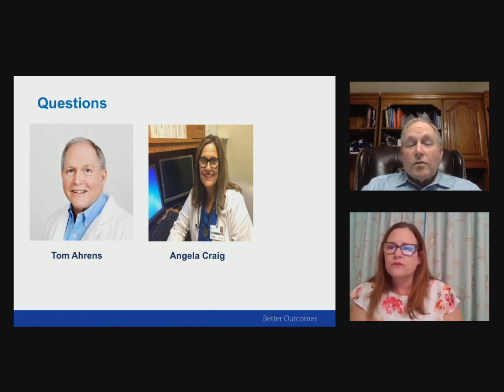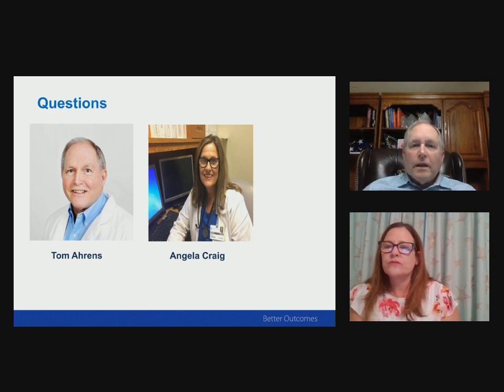Yeah, it's a wonderful question. Ideally in our COVID patients, we want to avoid intubating if we can. And so in order to do that, we've gone to high flow oxygen therapy, and in a lot of our cases, even using BiPAP. It's very difficult in high flow oxygen therapy, and so unfortunately, you might not have the capnogram available. Now, the ventilator is completely different, but it's just difficult if you're flushing out the exhaled carbon dioxide.